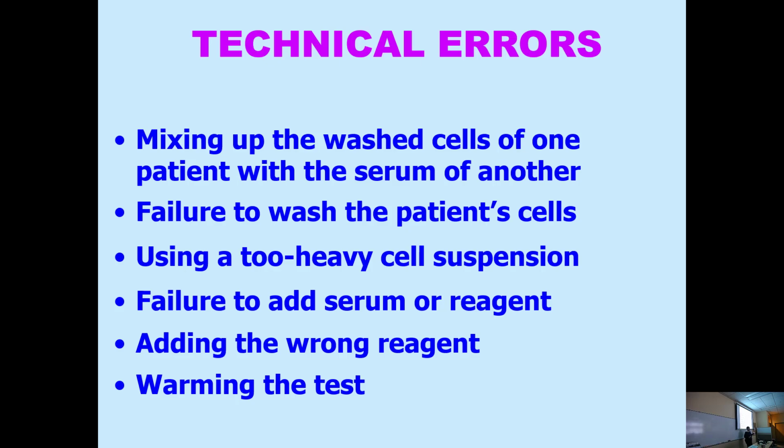Failure to add the serum or reagent. This is why one of my rules is you put all your clear in first, to make sure you put it in. All these things I've been hammering all semester, there's a reason for all of them, okay? I'm not just being picky. I mean, I am being picky, but it's all to protect the patient on the other side and to help you get in those habits. Quality assurance is what this is. It's quality practices that if you do them the same way every time, all the time, you never deviate.